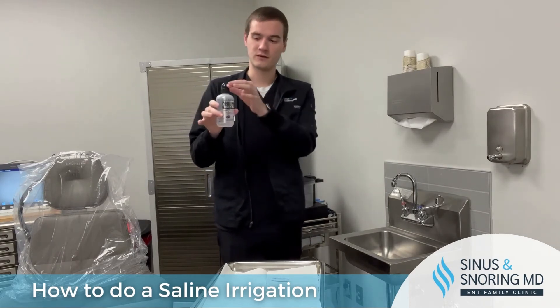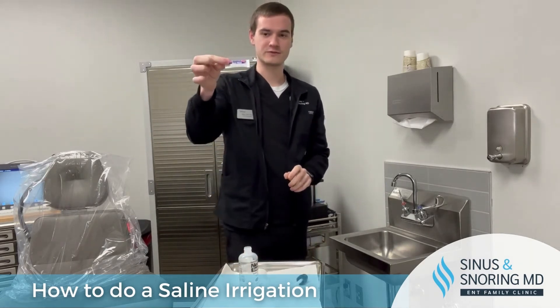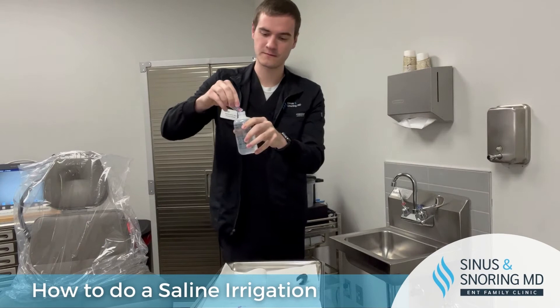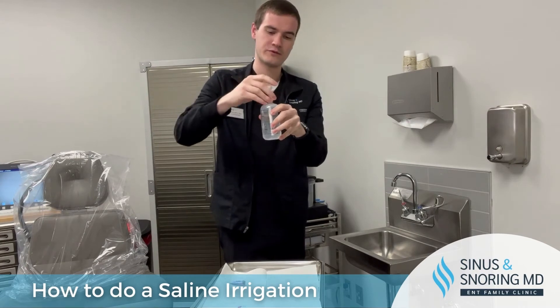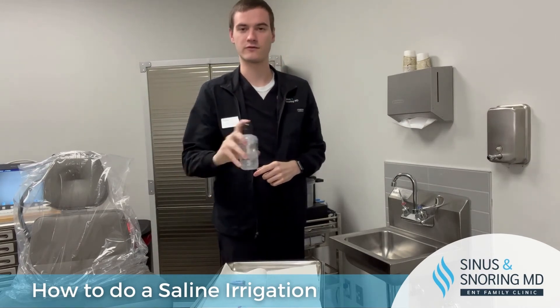Once it's filled up, you unscrew the cap, take one of the provided NealMed sinus rinse saline salt packets, break it open, and pour it into the rinse. Following that, put the lid back on. Put your finger over the top and shake it up a little bit just to mix the saline pack in.